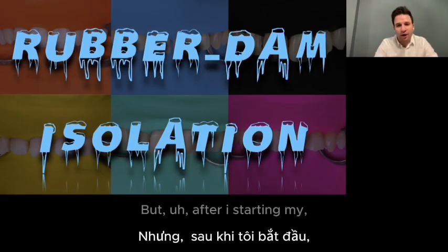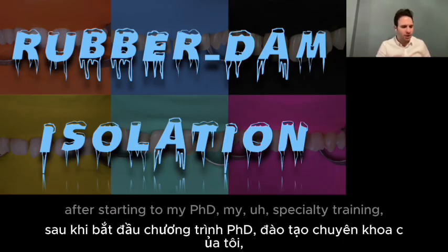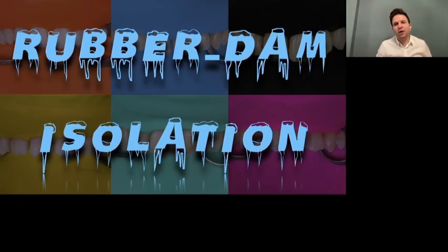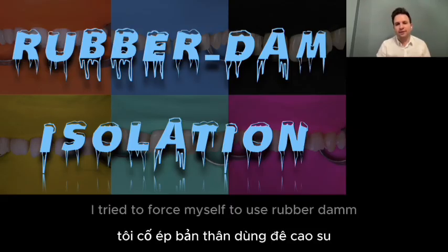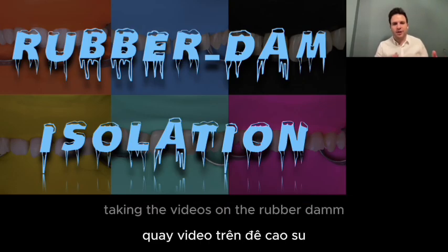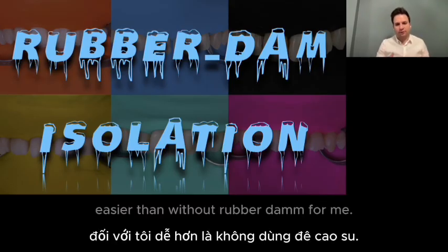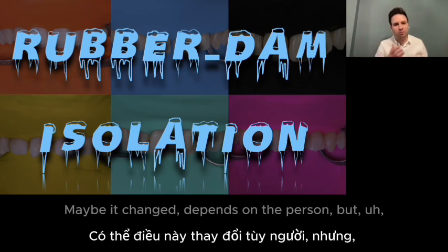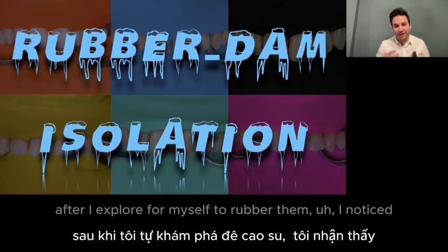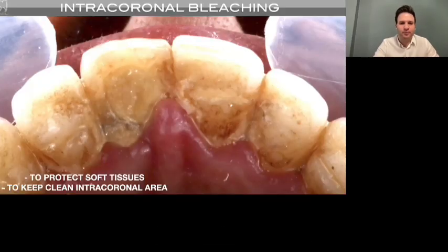But after starting my PhD, my specialty training, I tried to force myself to use rubber dam, because I noticed that taking photos and videos and working on the rubber dam is easier than without it for me. Maybe it depends on the person, but after I explored it for myself, I noticed that it's a very easy way to work.